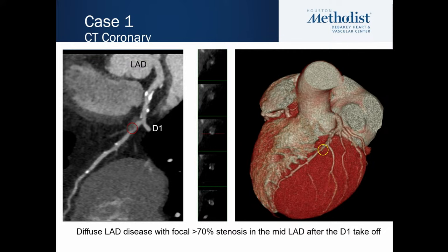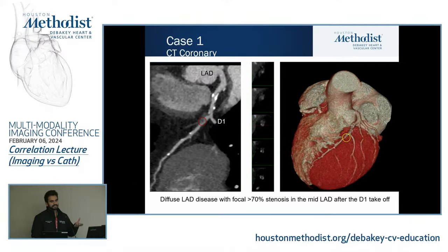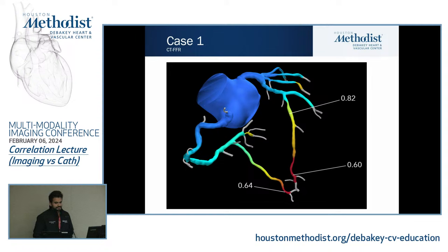We did send this patient for a computational fluid dynamics analysis, or CT-FFR. Specifically, we sent it to HeartFlow, and that's the vendor. We will go into more depth on the CT-FFR, but this is just a snapshot of what we actually got in this particular patient.